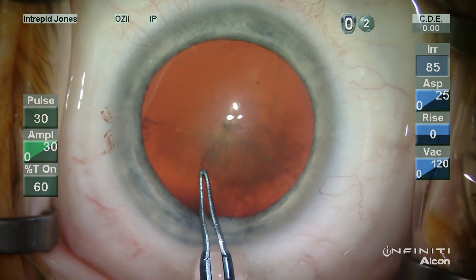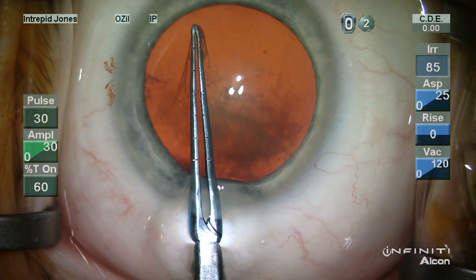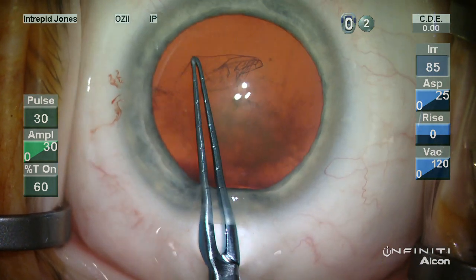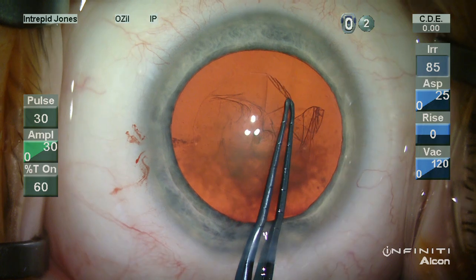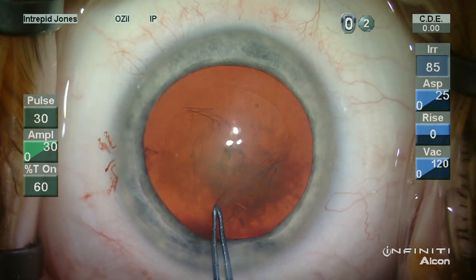The capsulotomy is then fashioned and follows the faint mark that I leave on the corneal epithelium to ensure that there is a good overlap of anterior capsule for the intended lens.